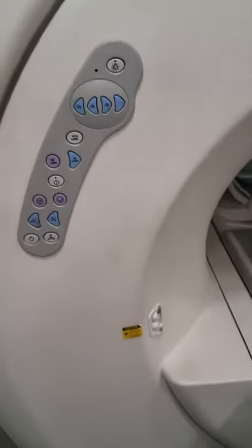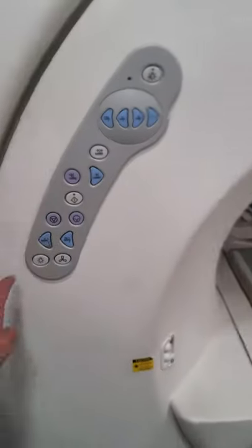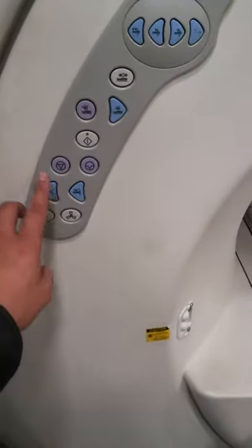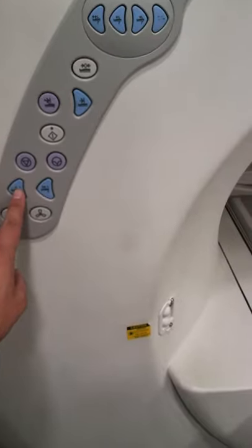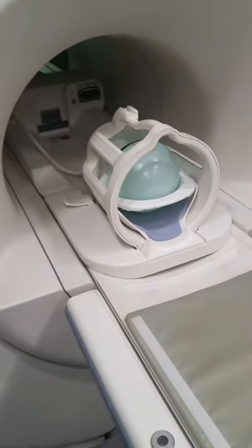We're in the GE machine room and I already have the brain coil in there, so we're going to get that out. What you want to do is press this button right here — that's going to bring it all the way out automatically. So it's coming out. What we have in there is a phantom.